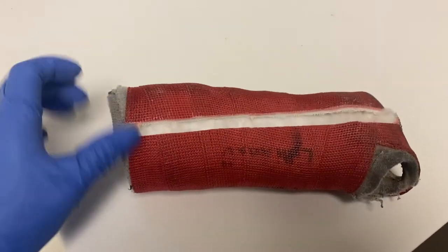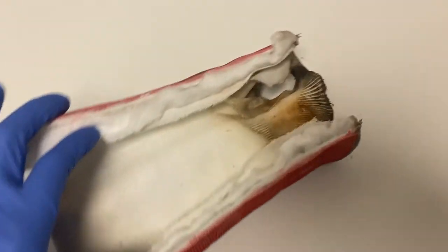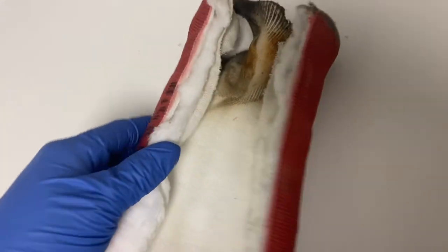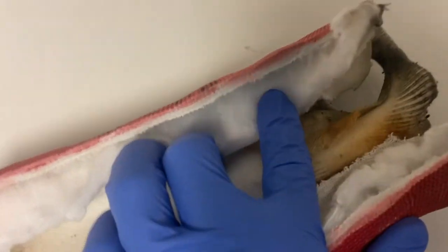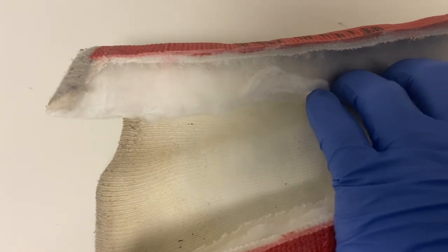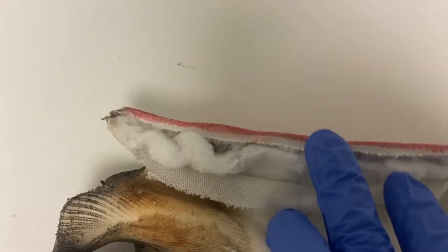Here is the same type of cast in a different color. By the fingers it is so much dirtier, and that's because the ages of the patients are very different. I also wanted to mention that the thickness of this cast is perfectly done — it's really common to see casts that are too thick around the wrist, but this cast is just perfect.